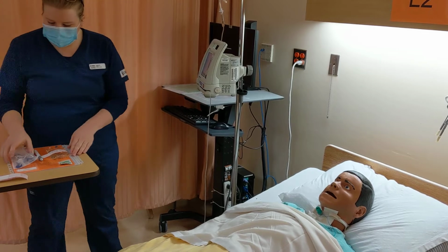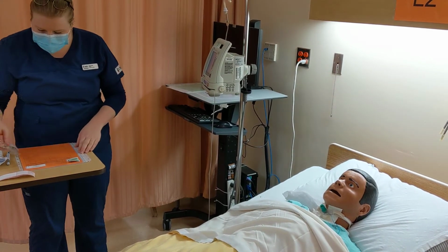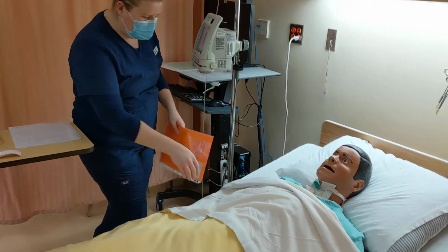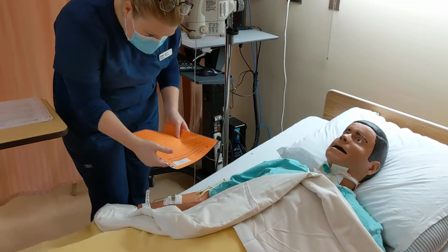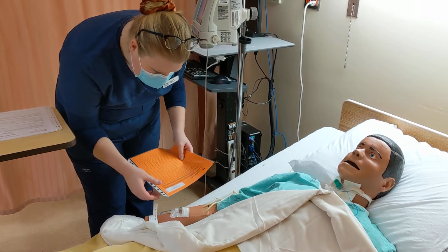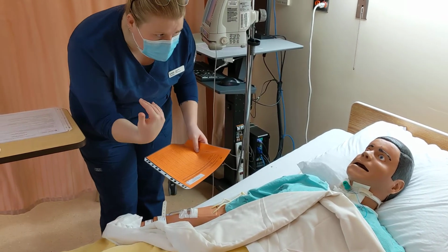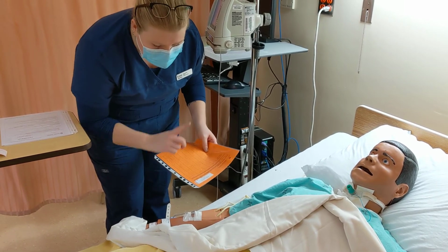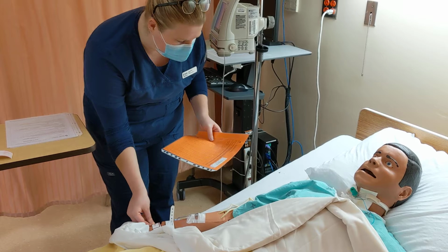After I do my entrance safety check, I'm going to put down my supplies here and do my check with my wristband. So we have right patient, Fiona Friedman, May 3rd, 1971, right birthday, and I'm going to ask for confirmation of the name and birthday so that she will tell me. I'm also going to ask about allergies. She says morphine, and that checks out. We also have a wristband for morphine here.